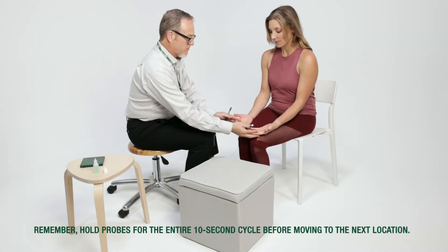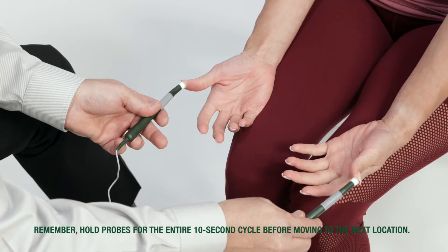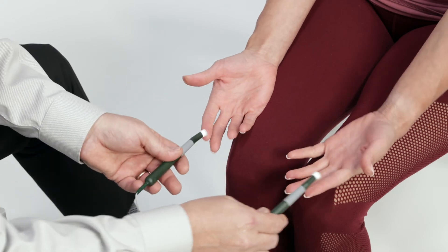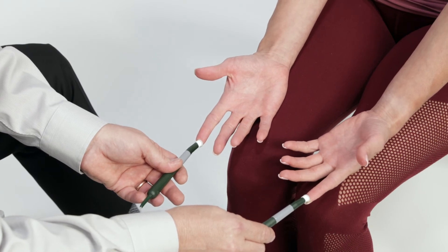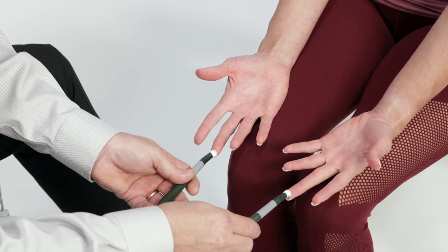To treat the neck and arms, including the fingers, hands, wrists, elbows, and shoulders, connect your two hands by placing one smart probe on one fingertip and the other smart probe in the same place on the corresponding fingertip of the other hand for 10 to 20 seconds. In other words, treat thumb tip to thumb tip on the other hand, then index finger, and continue for all five fingers.